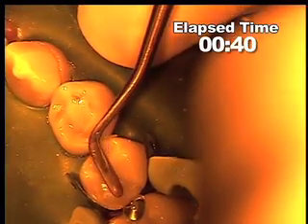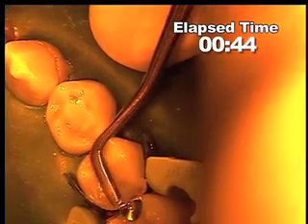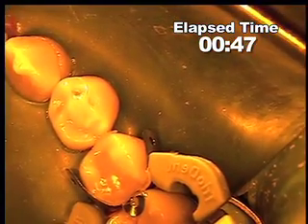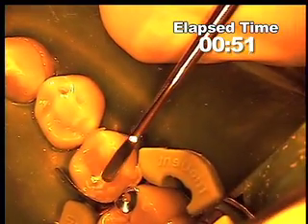I like to get my marginal ridge first and smooth that off down to the level that it should be, which is the opposite of the adjacent to the marginal ridge.